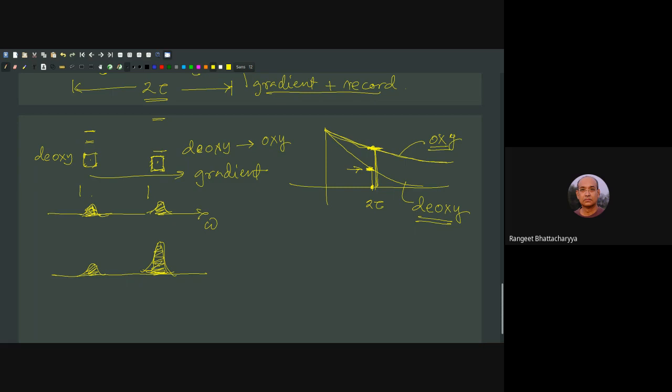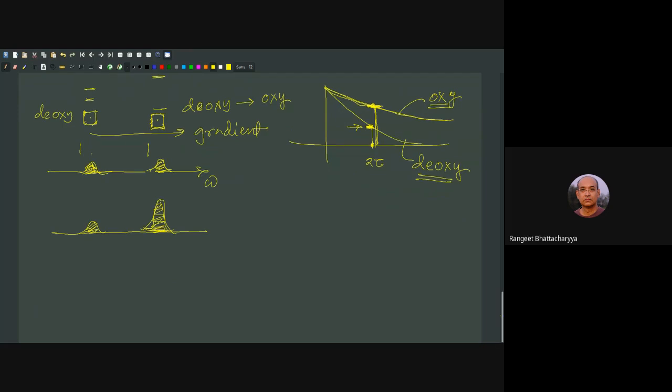It's very good. So what is the next step? Next step would be take the difference between the two spectrum. So if you take the difference of the two spectrum, what do you get? You get 0 here, nothing. And here you have something. So you would say this is fMRI, the functional MRI I recorded. I found that this is the place where some activity is taking place. This is the simplest 1D image that I can record.